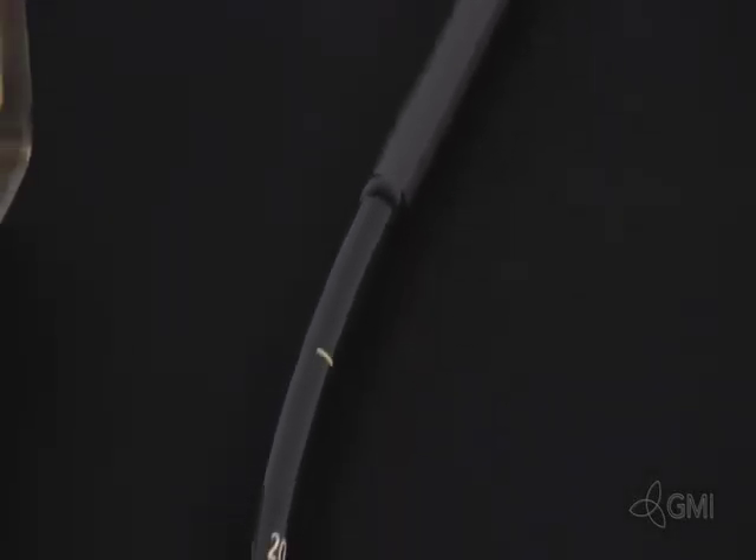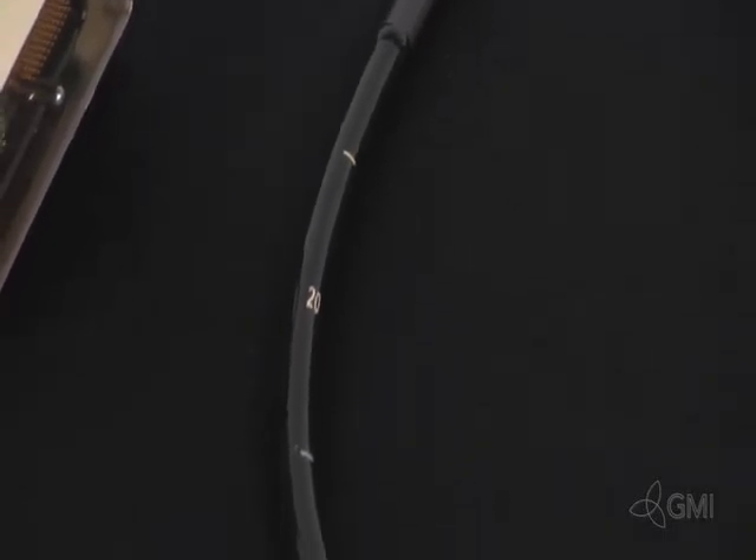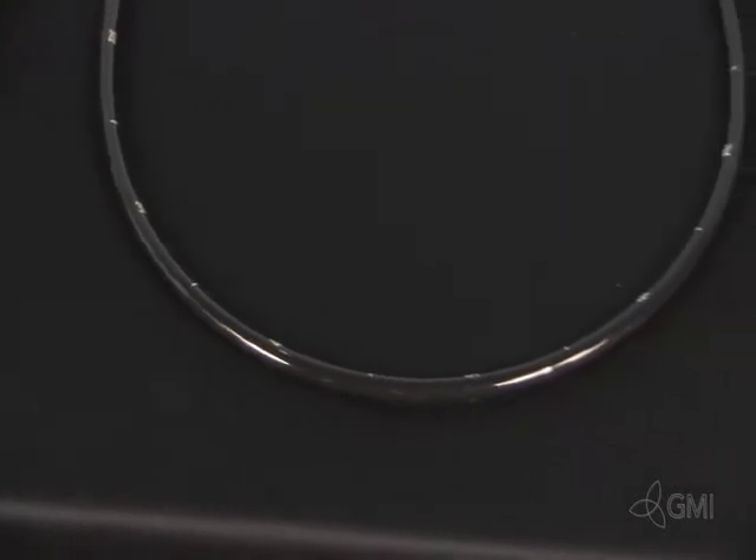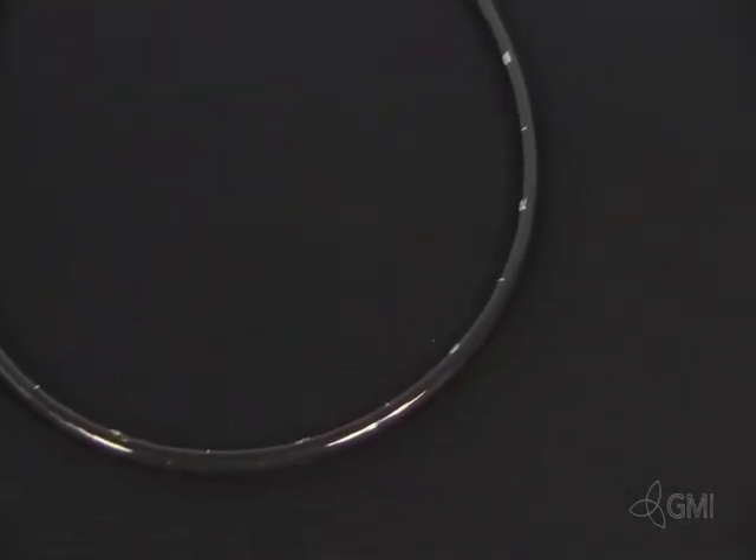This is a typical TEE or transesophageal transducer. This transducer is used to perform unobstructed cardiac ultrasounds. The TEE is inserted into the patient's esophagus to view the heart and is one of the only invasive procedures in ultrasound.